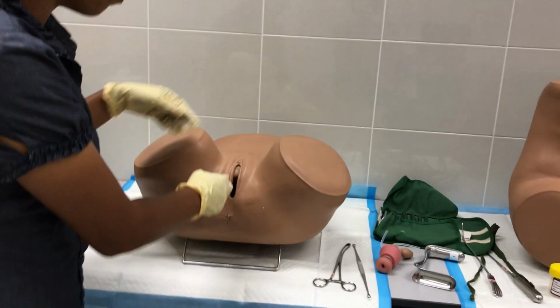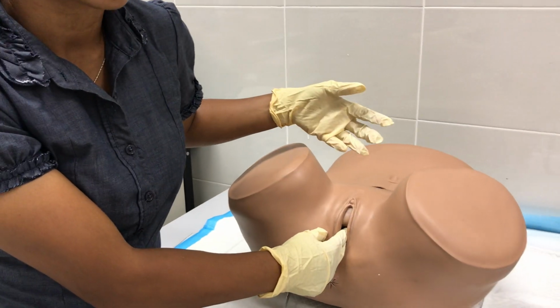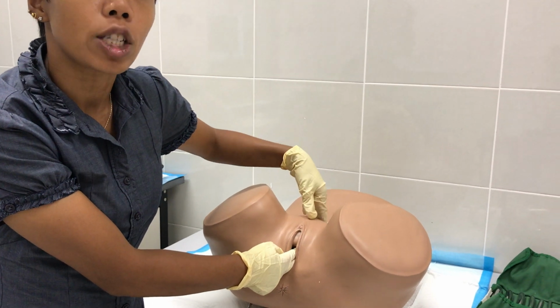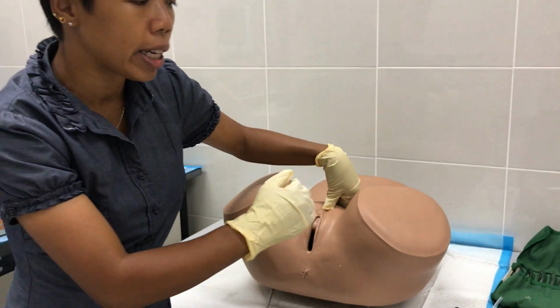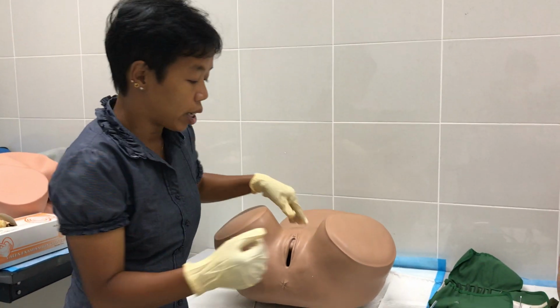So after all is finished, you make sure you check again. By right, if you're doing the suction curettage or termination of pregnancy, after the procedure, you can find that the uterus is getting smaller and there is no more bleeding. Then after that, only then you finish your procedure and then you can send the patient back to the normal gynecological ward. So that is all.